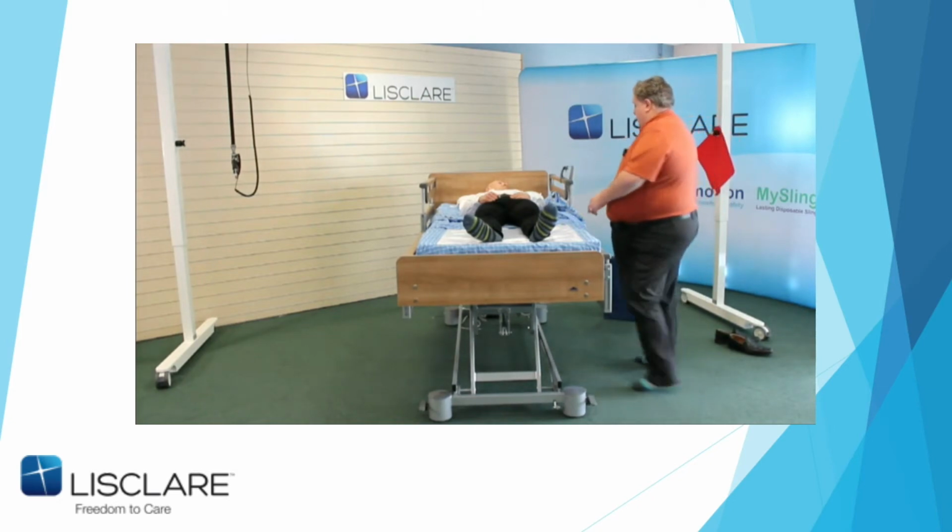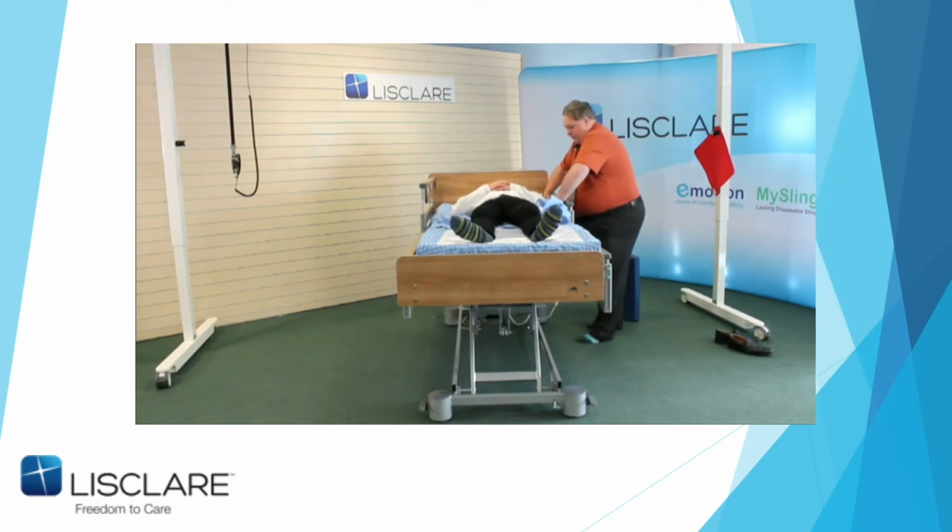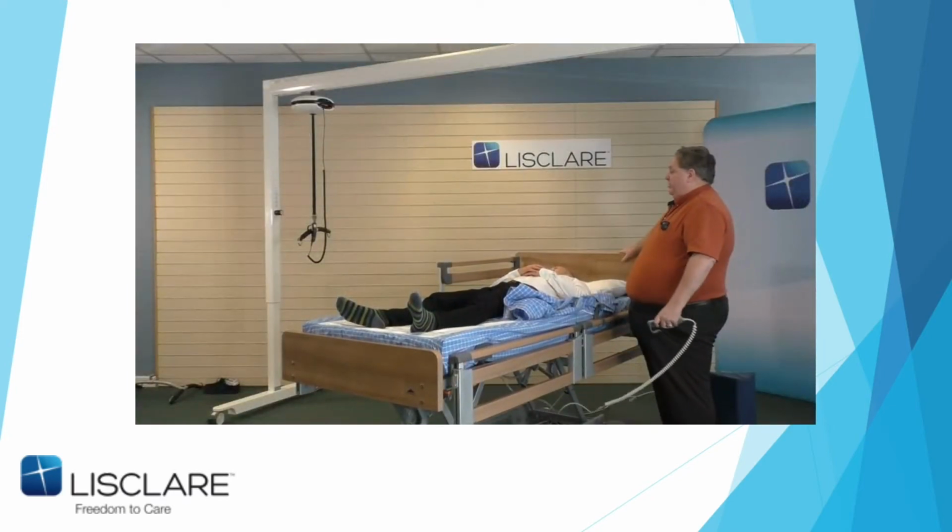All right, so poor John now gets turfed out of bed. Stay where you are, John. I just lower this down. Turfed out of bed. Sorry, that's an Irish expression. This is St. Patrick's Day tomorrow.